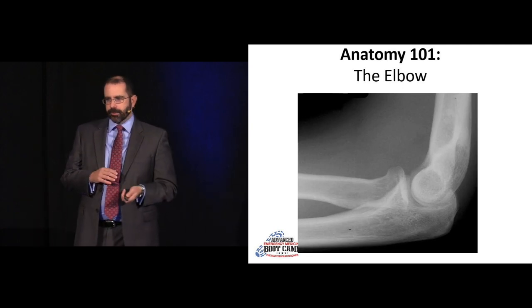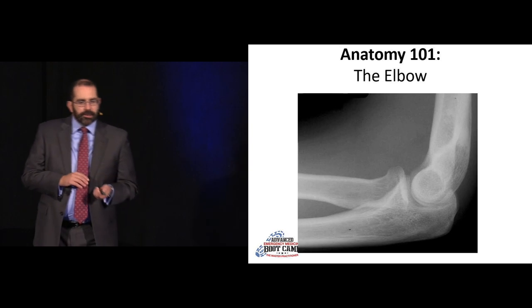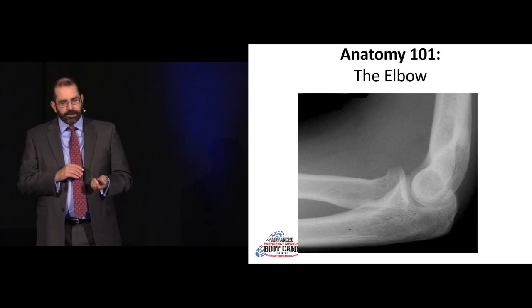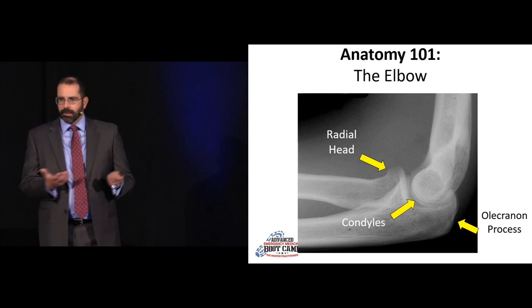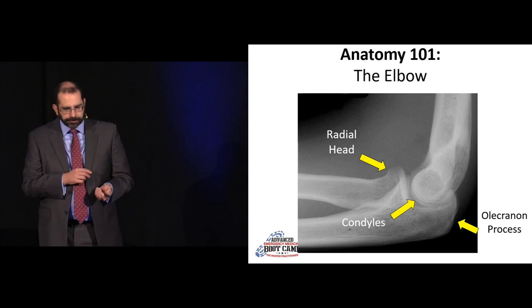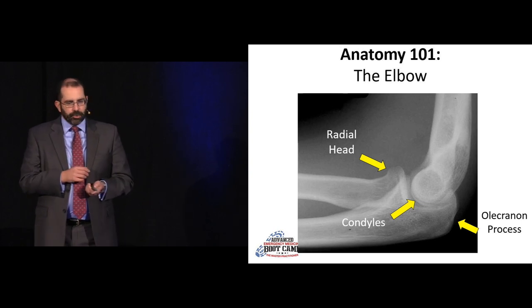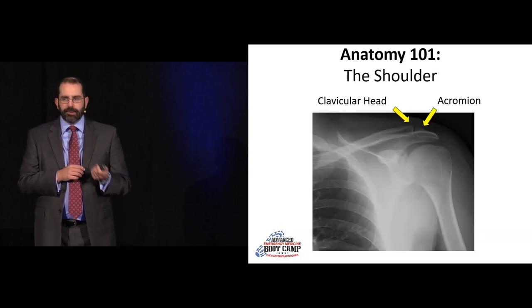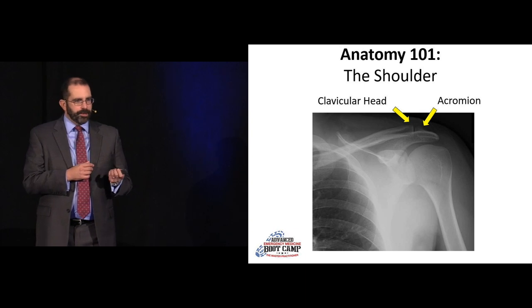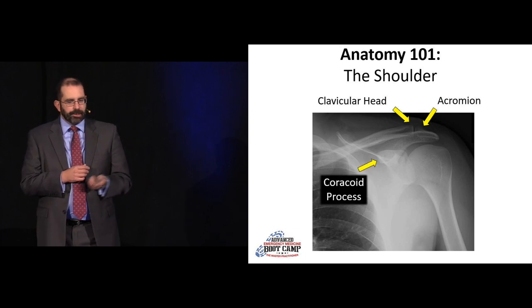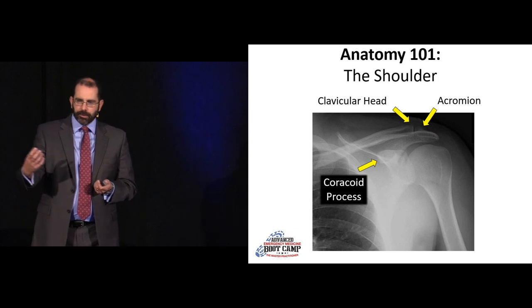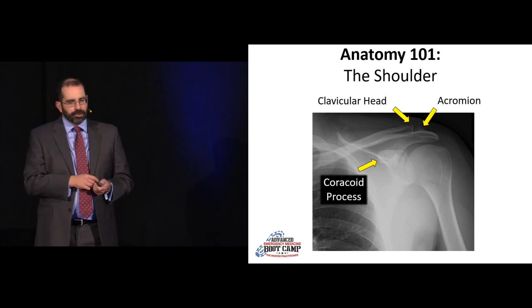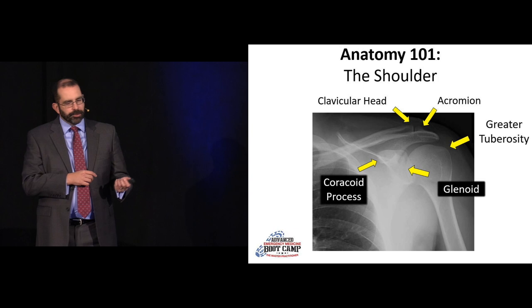Moving up into the elbow: there's your radial head, your olecranon, your articulating condyles, and they should form that nice figure-of-eight or hourglass appearance. Moving up into the shoulder: you have your clavicular head and your acromion — together they form the AC joint. There's your coracoid process, the crow's beak coming out at us, your greater tuberosity, and your glenoid.